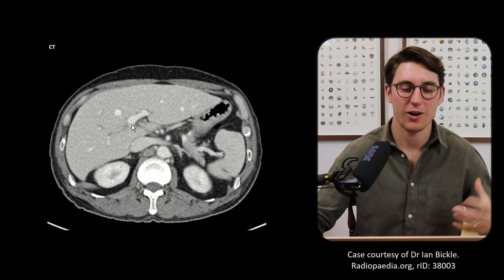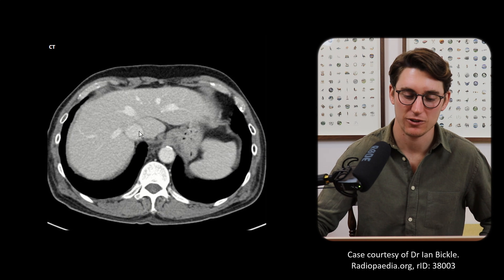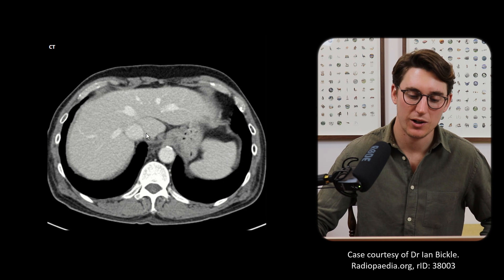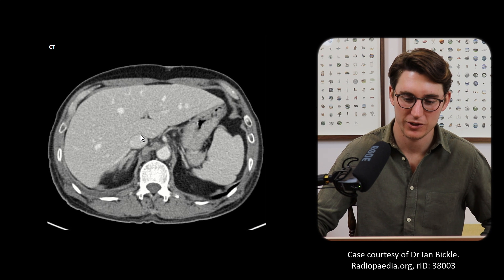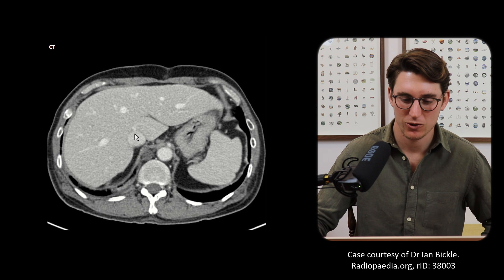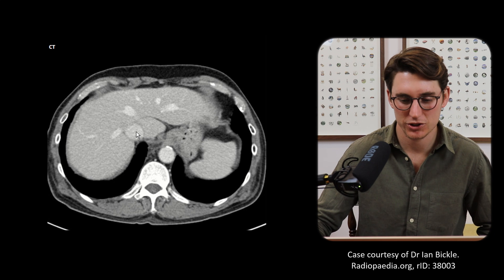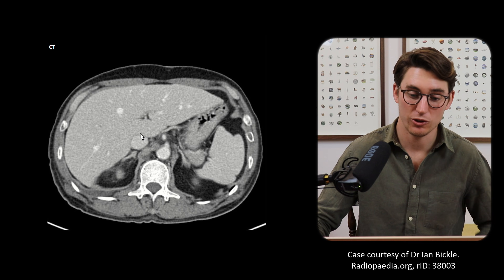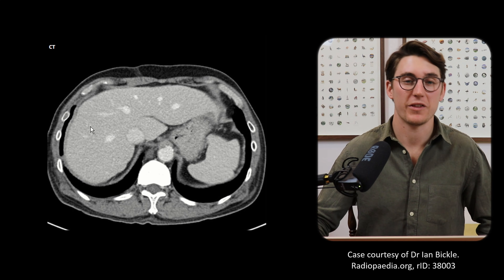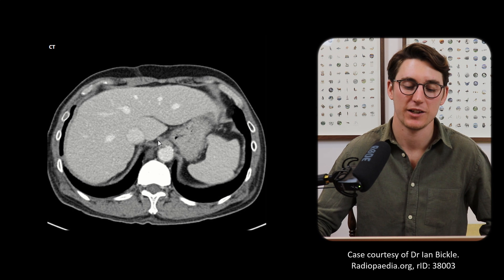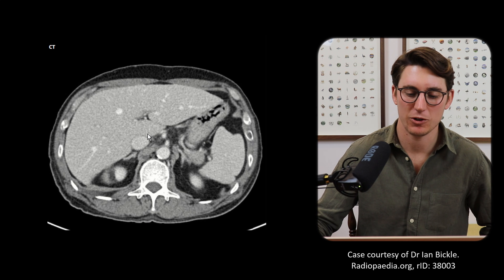Let's start at segment one and work our way to segment eight. Starting at the top of the liver, just medial to our IVC, there's this functional unit — a separate lobe called our caudate lobe. We can scroll all the way through it and see a vessel coming into the caudate lobe and a vein draining into the IVC. The caudate lobe is clinically important — look at its size especially, as it can become much bigger in cirrhosis. As the right lobe gets smaller, the caudate lobe gets bigger, and the ratio between those changes can be used as a marker for cirrhosis. That is segment one.